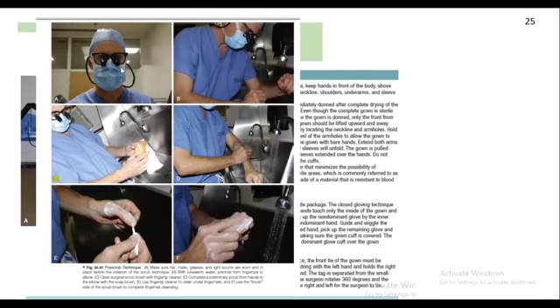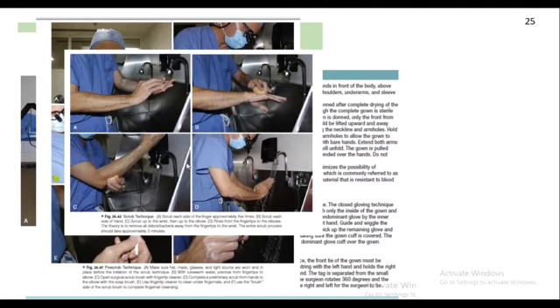First, before everything, you need to wear your mask, your head cap as well as your loupes. Then you need to wash your hands and scrub the area properly. You need to remove all the dirt from the nails with the brush. Then you need to do elbow scrubbing.